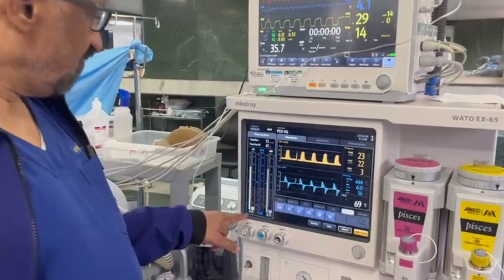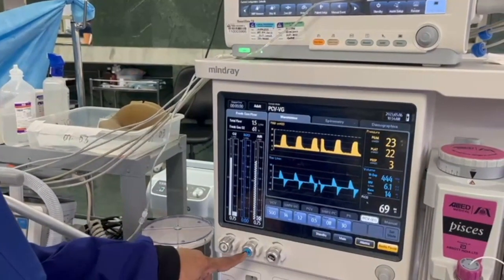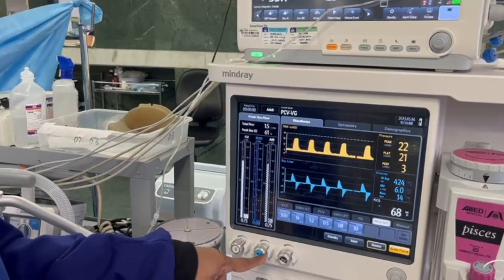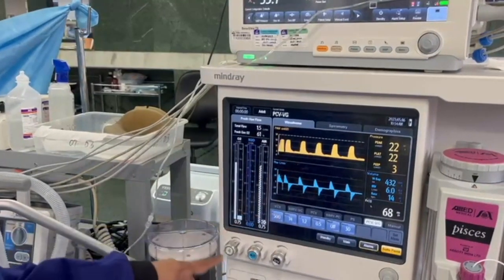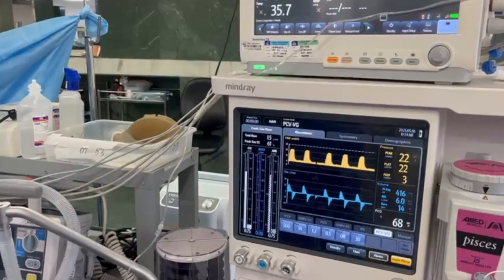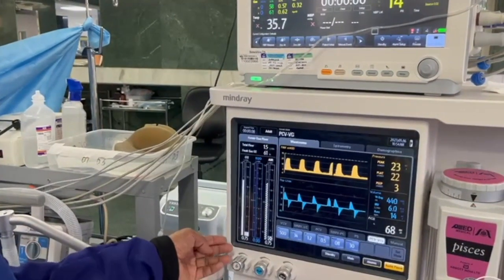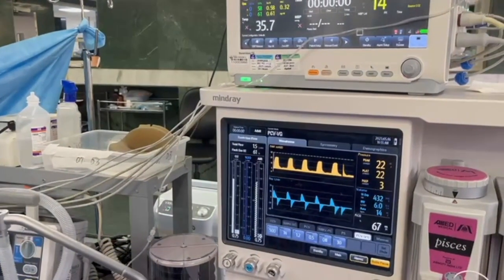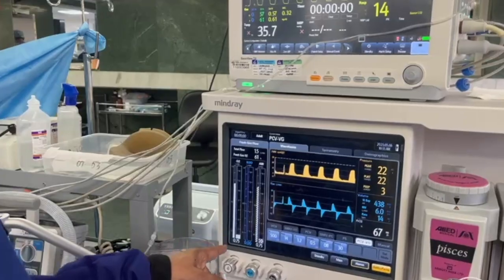One is the fresh gas flow here. We have the knobs for the fresh gas flow, the oxygen, nitrous oxide and the air being shown here. The knobs are color coded and you also have a digital as well as analog representation of the fresh gas flow. If you notice, even the flow meter is color coded so that we do not make mistakes. Usually we use 50-50 of oxygen and air in cardiac patients unless there is hypoxemia. In normal patients we use 50-50 of oxygen and air.